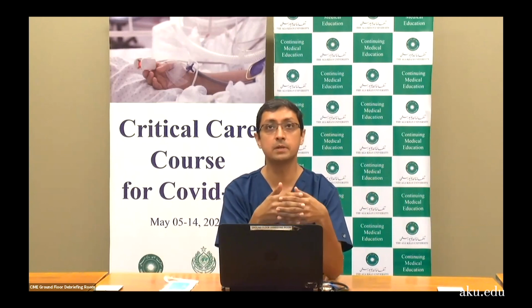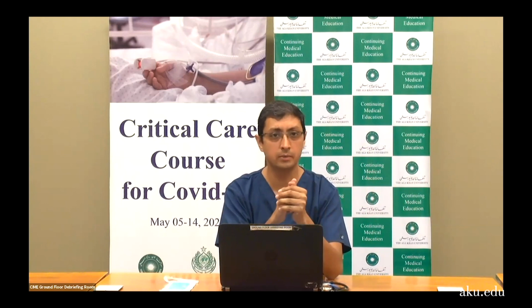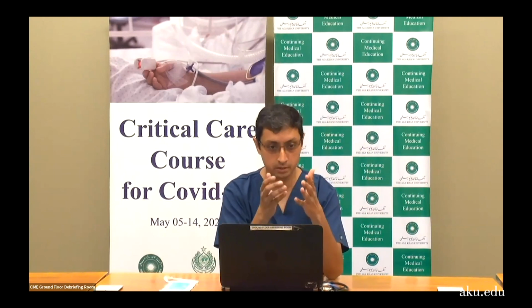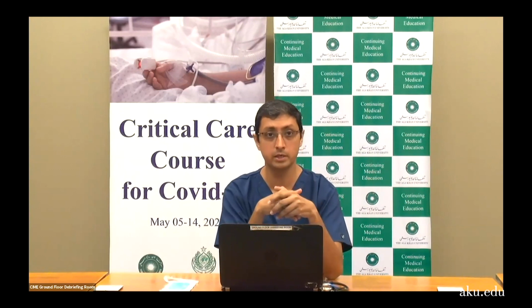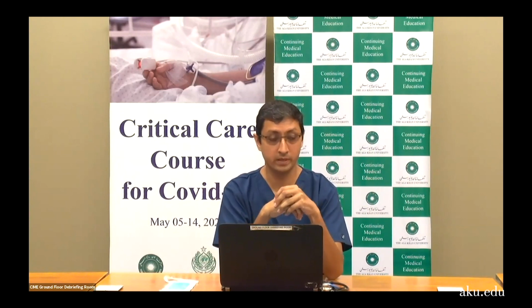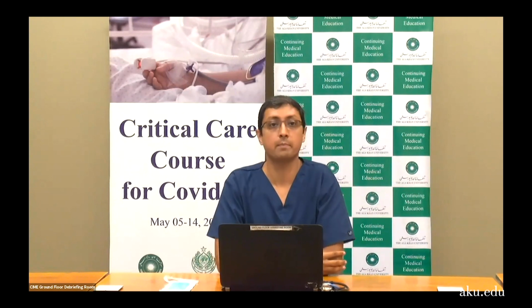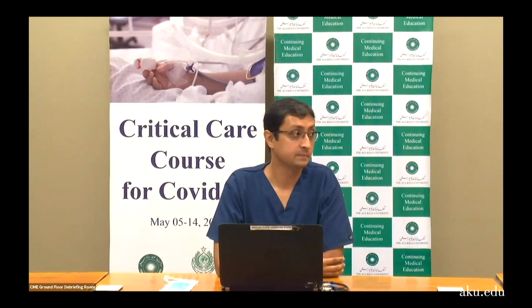This concept has been around since the 80s, and it has been published in Pakistan as well. There's a paper published by Brigadier Salim as well with diagrams. And if it hasn't taken on in the last 30 years, I don't think it will. I would not recommend it. I do not think it should be used. Using one ventilator for multiple patients is not recommended at all.